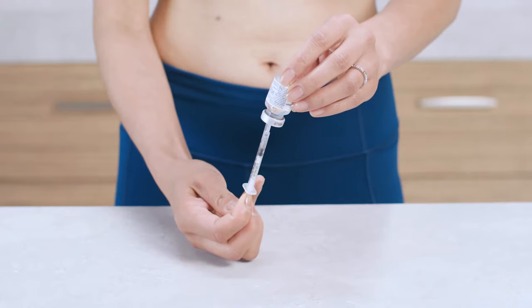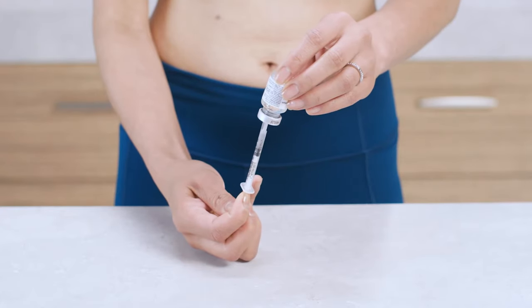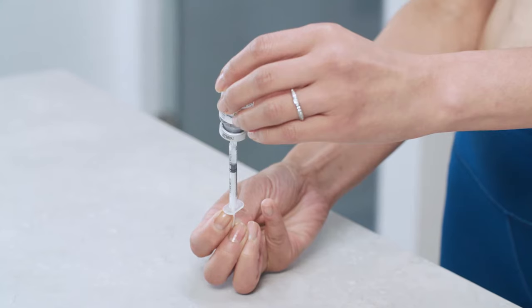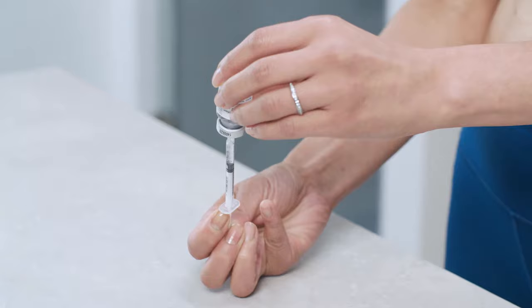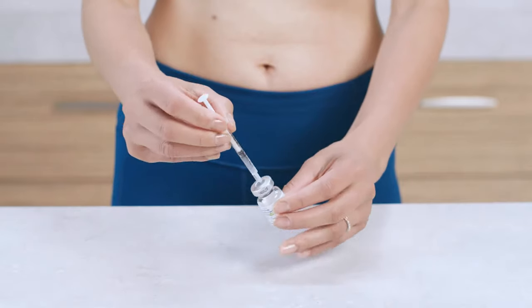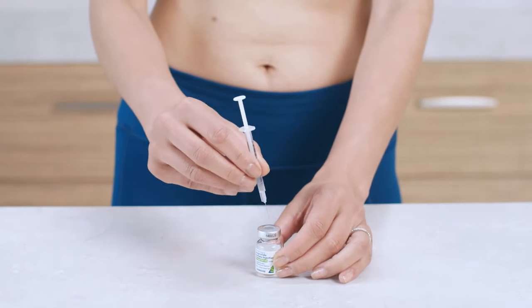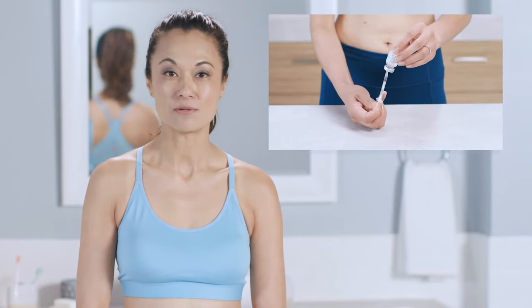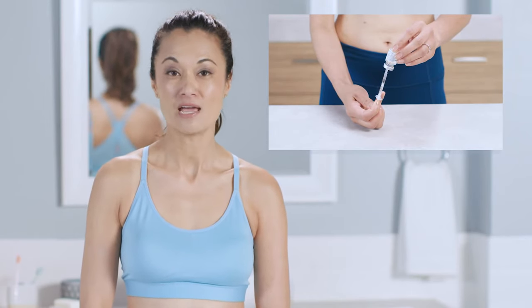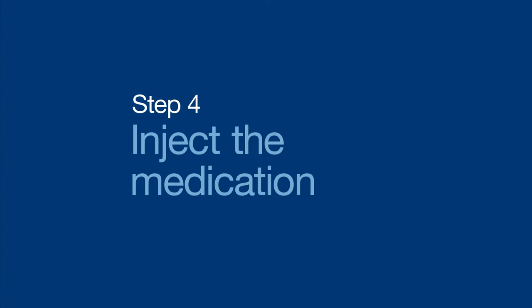Make sure the tip of the needle stays submerged in the solution as you slowly pull back the plunger to withdraw your dose. This is especially important as the amount of medication decreases in the vial over time. With the needle and vial still upside down, check to see if there are any air bubbles inside the syringe. If there aren't any, remove the needle and syringe from the vial and replace the cap. If you see bubbles, press the plunger to push the bubbles back into the vial. You'll have to withdraw your dose again, so repeat the earlier step of submerging the tip of the needle in the solution and slowly pull back the plunger to withdraw your dose.